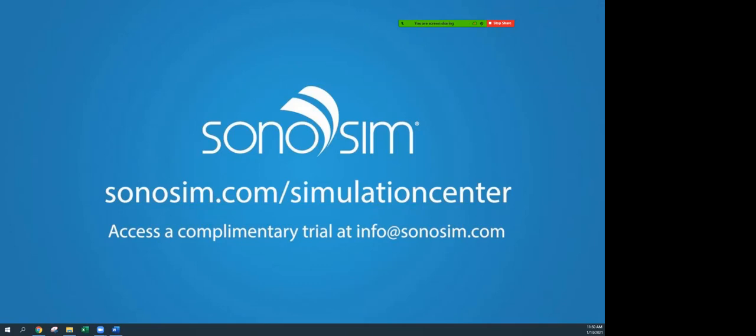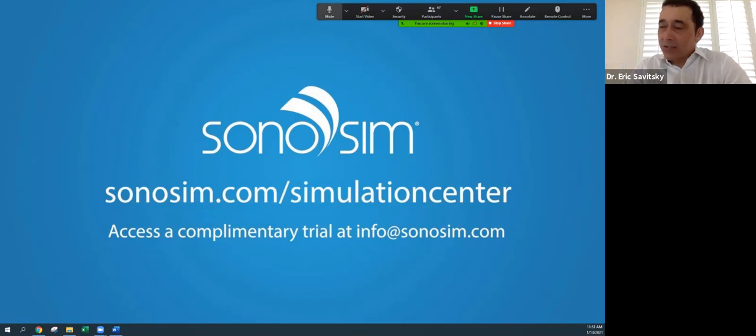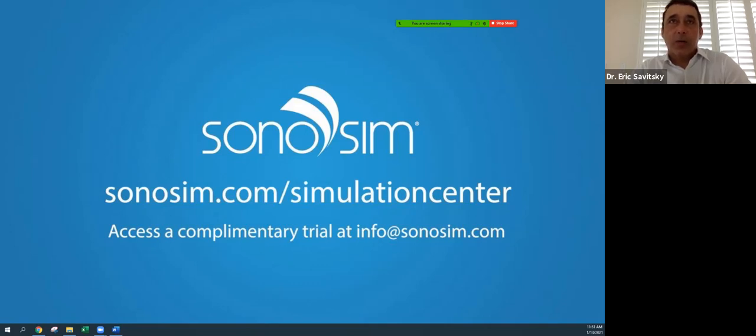I have SonoSim, but my software does not include CT and 3D images. How can I attain updating the software? Yeah, great question, and it's our own shortcoming for not letting you and people know that it probably exists when it does. So when you look into the SonoSim ultrasound user interface, when you see the ultrasound images, there's basically one button there that allows you to shrink the screen or expand the screen.